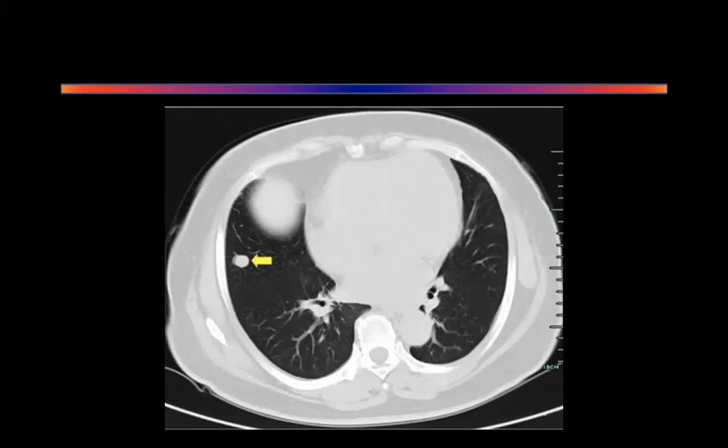So, Prof, this is another CT scan of a chest, and that is showing a homogeneous small opacity with regular margins in the peripheral lung field on the right-hand side. And just let me have a closer look at that. And actually, the periphery is less dense on the lateral side as compared to the whole of it. Very good, very good. Differential diagnosis?